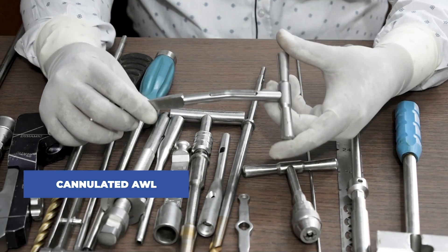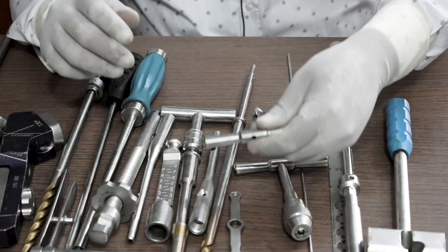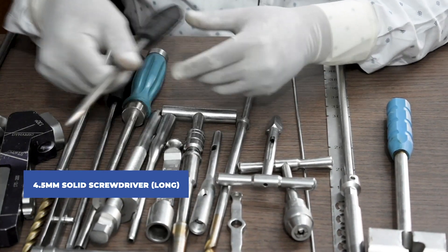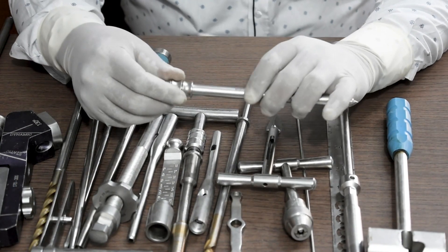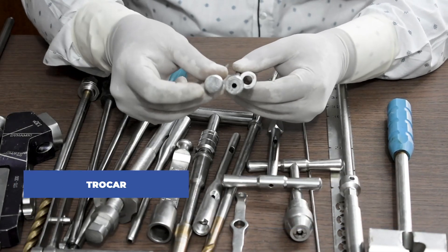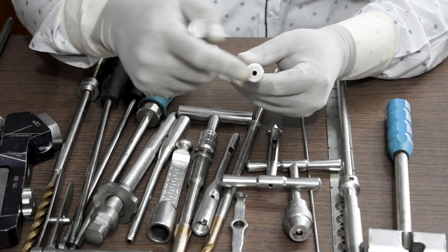This is a cannulated awl, used to create the entry point for the nail. This is a 4.5mm solid screwdriver, long. This is a protection sleeve for the 4.9mm locking bolt. This is a drill sleeve for the 4.9mm locking bolt. And this is a trocar — this helps us to fix the bolt in the nail.